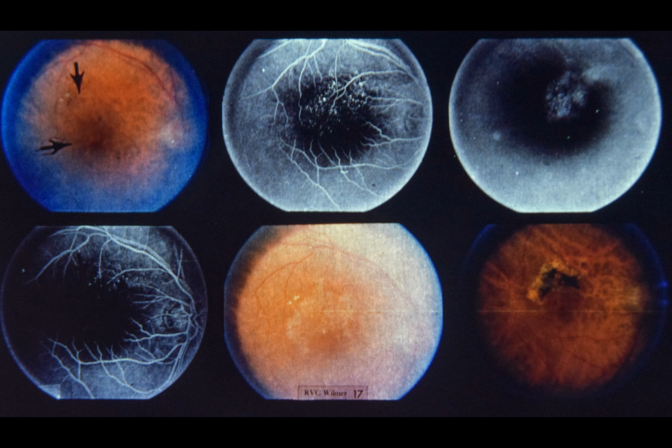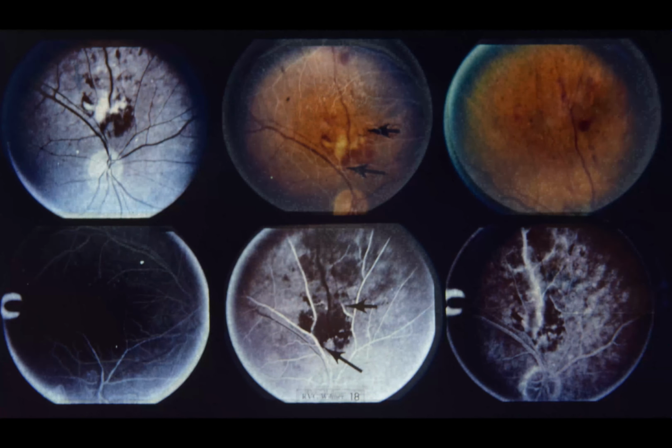Comment: this slide illustrates the technique of argon laser photocoagulation treatment being used in the clinical trial for branch retinal vein occlusion now in progress at the Wilmer Institute. If visual acuity is 20/40 or worse due to macular edema 6 months after acute venous occlusion, patients are randomized into a treatment or non-treatment group. Treatment consists of argon laser photocoagulation directed towards areas of retinal non-perfusion and to capillaries which leak into the macula.